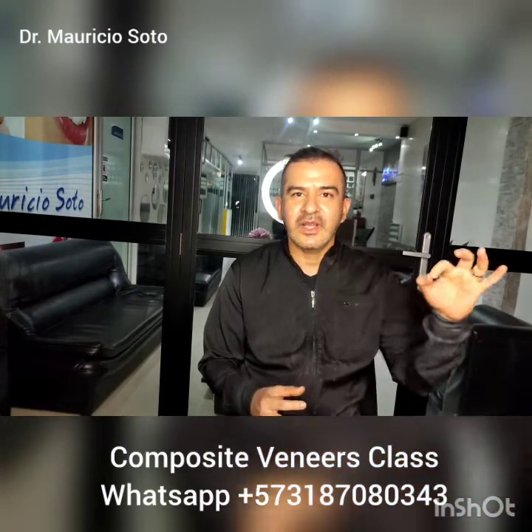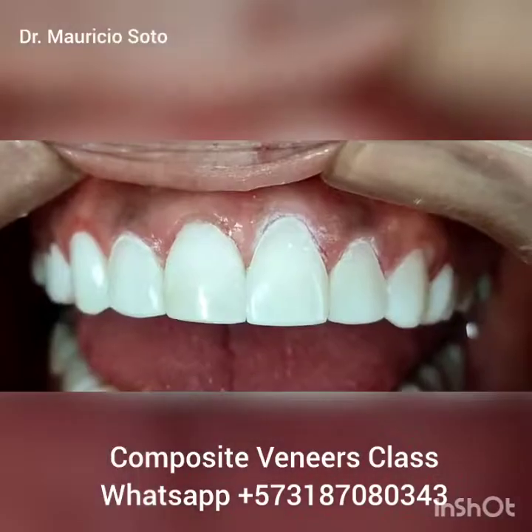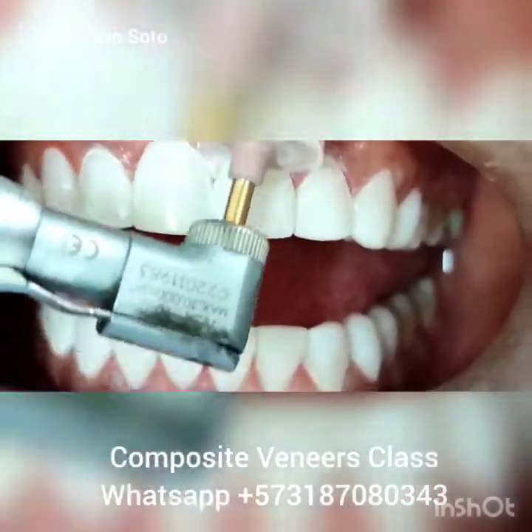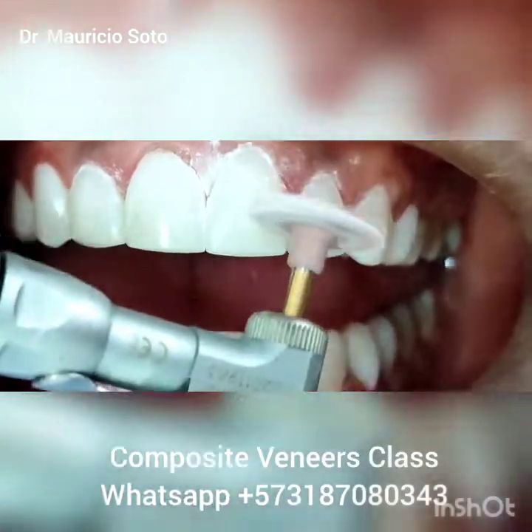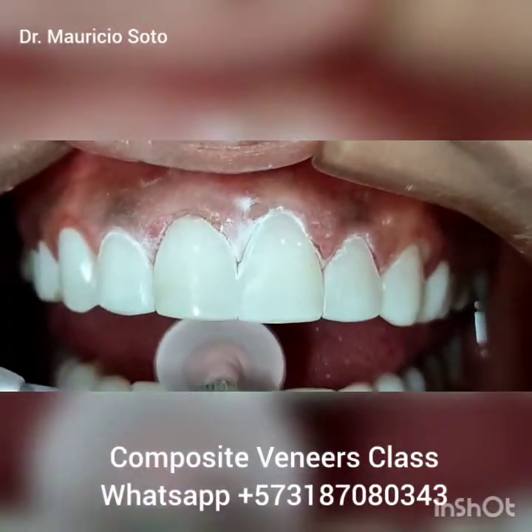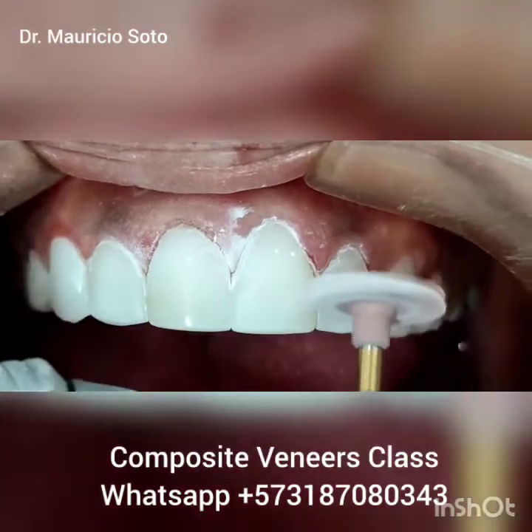I start with a pink wheel — the pink wheel of the Eve Diacom system — and I pass this wheel on all the surfaces. This is the Eve Diacom pink wheel. It's an abrasive wheel. With this wheel you can remove some excess of composite and do a prepolishing, a preparation of the surface of the composite for the shine. But with this wheel you don't obtain shine — it's a prepolishing wheel.